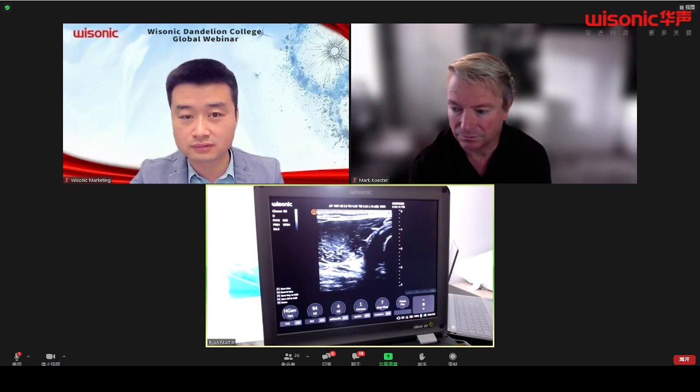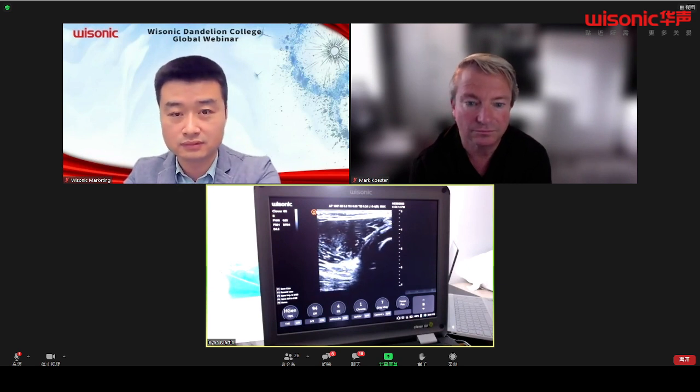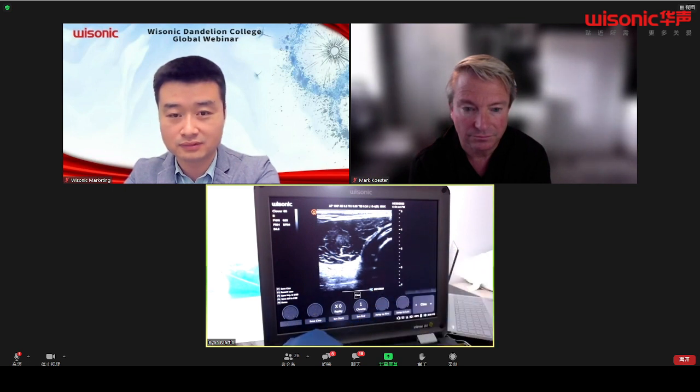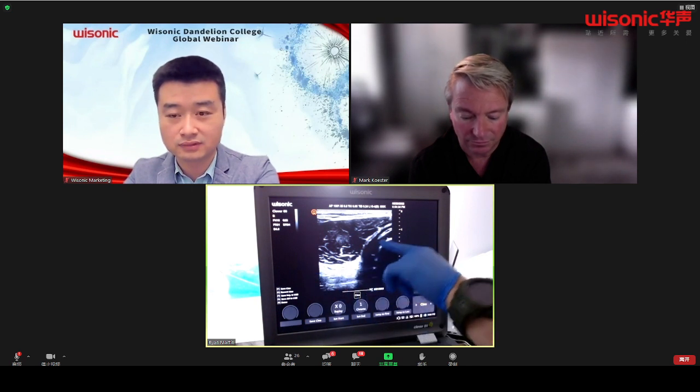Now I could have my patient pronate and supinate, nice and easy. And you'll watch that tissue. There it is. You'll see it rotate back and forth. One more time for me. There you go. So I'm going to see if I can tone this down a little bit. Okay, here's your biceps brachii, that distal middle third right in here, right through the radius.